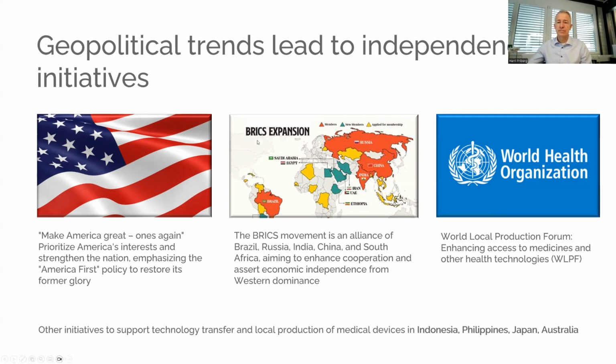Number one, and what I mentioned, is most ventilators are manufactured in 2 or 3 parts of the world today. You have the USA base of manufacturers, you have the European base of manufacturers, and there is a base of manufacturers in China. And with these geopolitical trends, everybody has a slight problem. If we start on the left, if we look at the USA, Make America Great Again. When we had a pandemic, America withheld all their ventilators for their own use. You could not get an American ventilator until they had satisfied their supply.